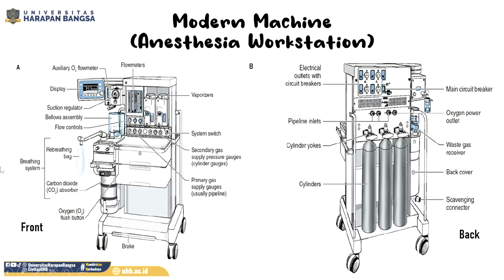And now, looking at the back side, we have electrical outlets with circuit breakers and the main circuit breaker. And the next is the oxygen power outlet.